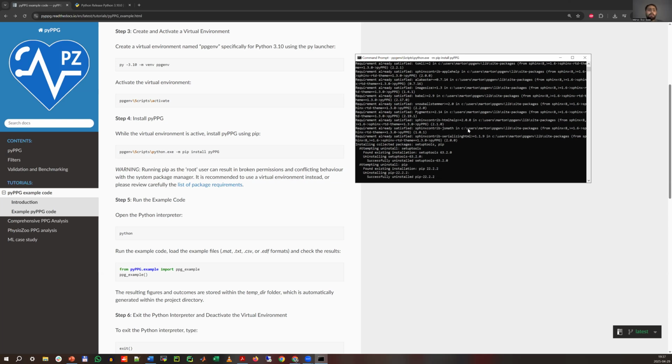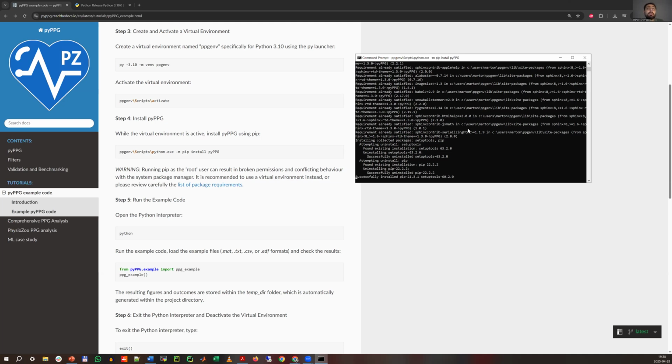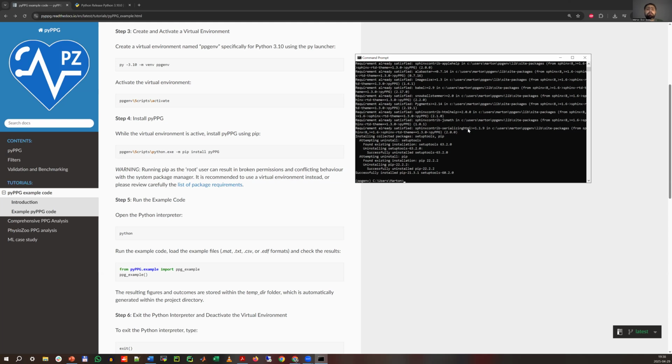What is important is that when I created this toolbox, I tried to make it as compact as possible, which means that what you can see in the requirements.txt is already built in during the installation.